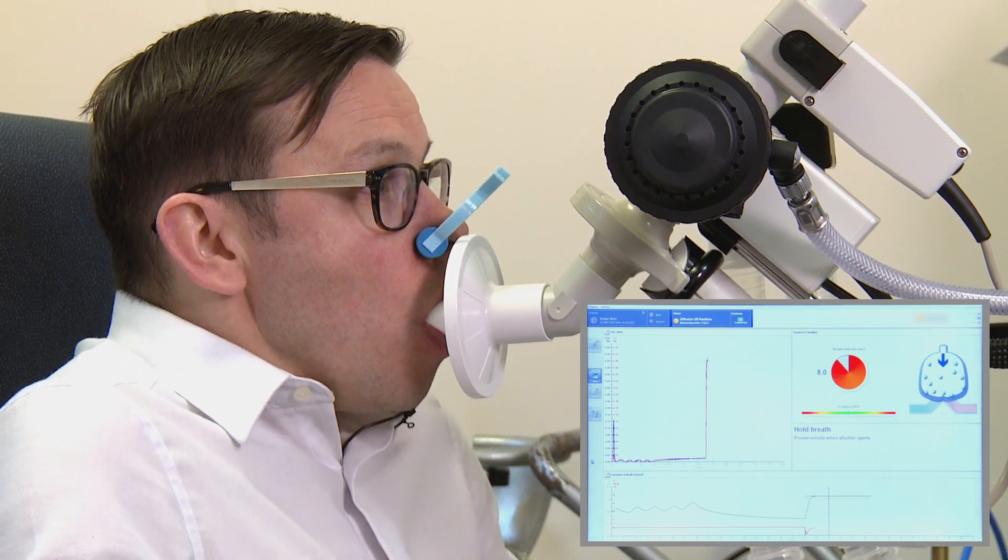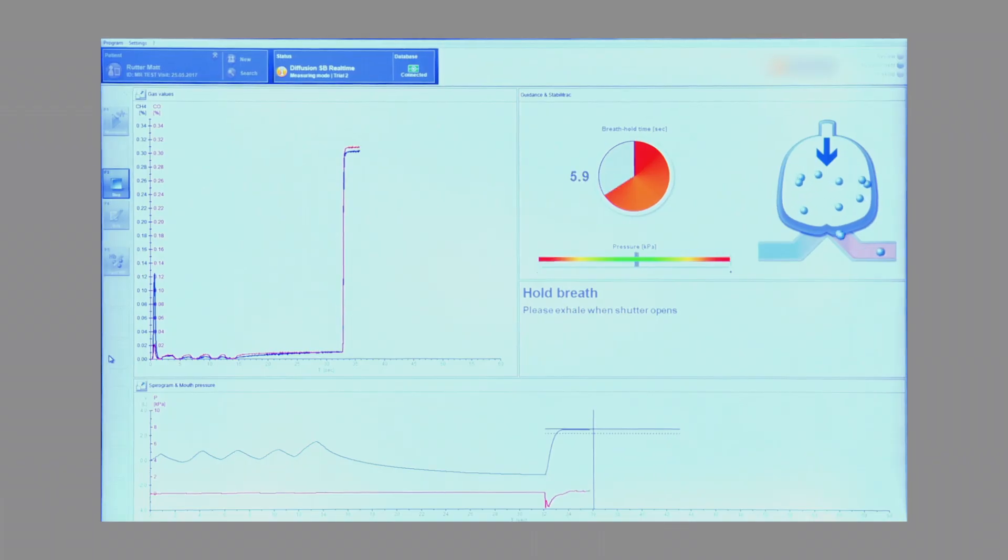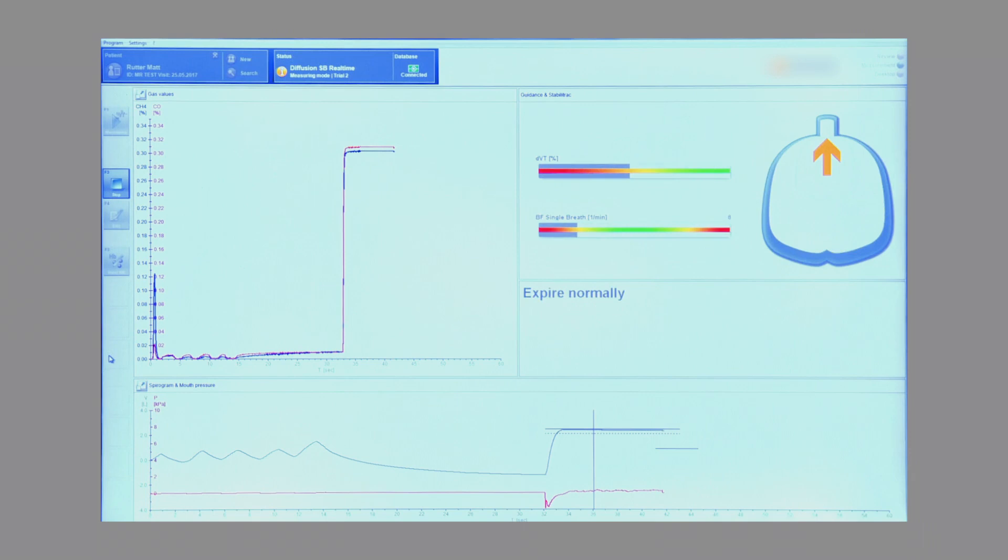Big stretch. Up, up, up, up, up, up, up. Hold your breath for me there. Keeping those lips tight. Just got another four seconds left. Two more seconds. Lips tight. And breathe back through the tube.